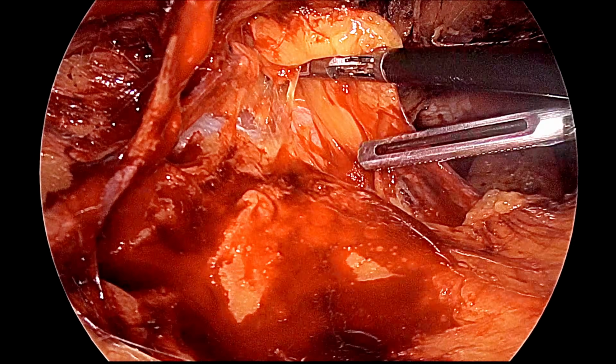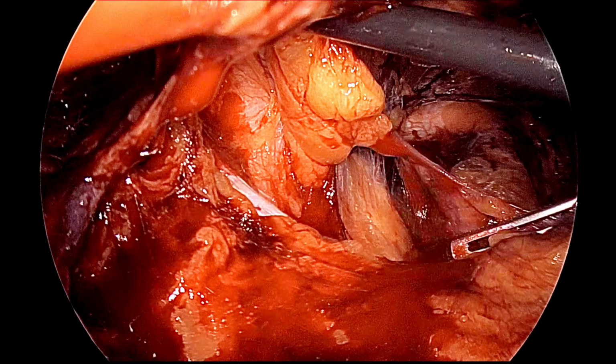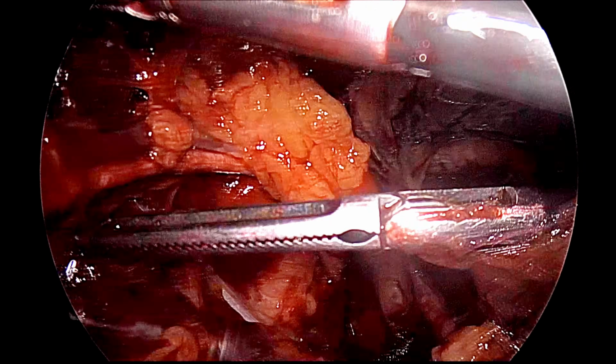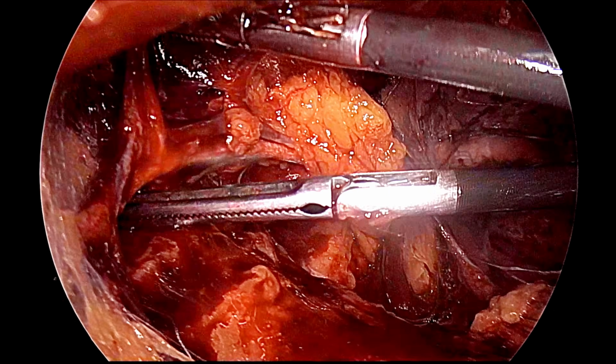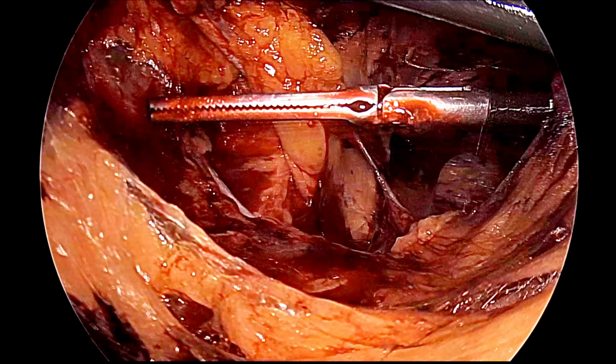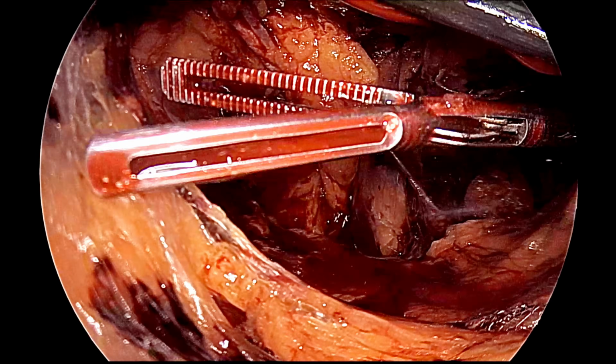Here you can keep the pressure up to 18 millimeters of mercury also, because in this case the gas is not going into the abdominal cavity. So, there is no risk of pressing over the vena cava or diaphragm. So, even if you increase the pressure a little bit, there will be no problem.